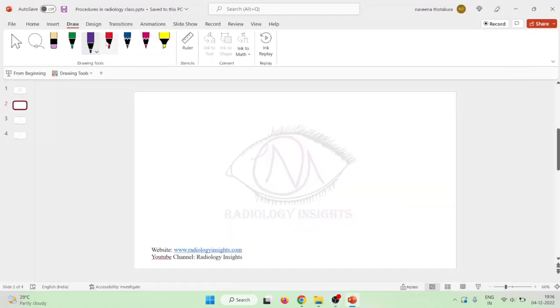Hello friends, let us now learn some important points about intravenous urogram. Intravenous urogram is a radiological examination of the urinary tract, that is starting from renal parenchyma, calyces and pelvis. So it helps in radiological investigation of renal parenchyma, and we can also know about the calyces and also about the pelvis.